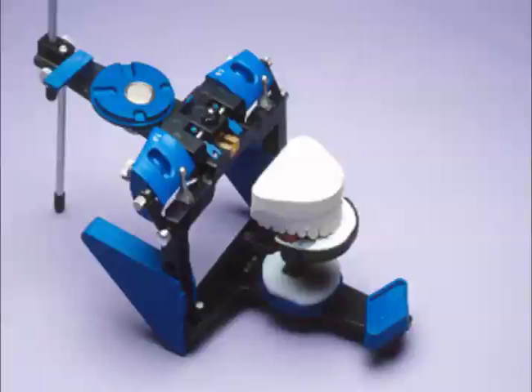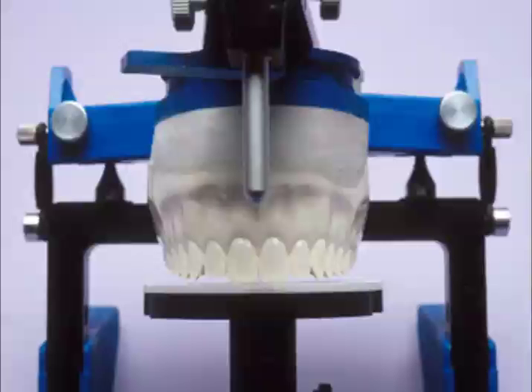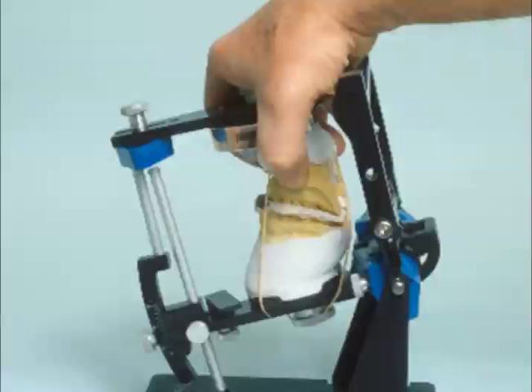So now we can add a mounting plate and plaster and make a connection of the upper cast to the upper frame. And I believe the upper cast should be more of an aesthetic relationship. It does have to be related to an axis of rotation because we use that upper cast to mount the lower cast with the centric relation record, which is your functional mounting. It'll dictate how the lower teeth approach the upper teeth as long as you're within a statistical average of the axis of rotation.